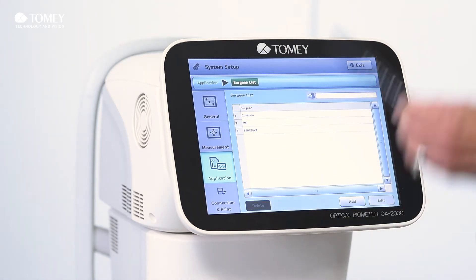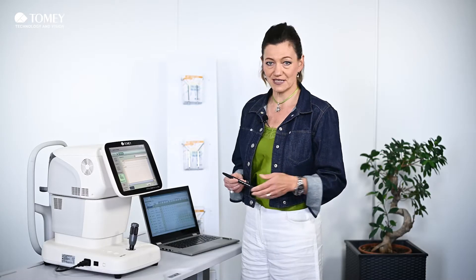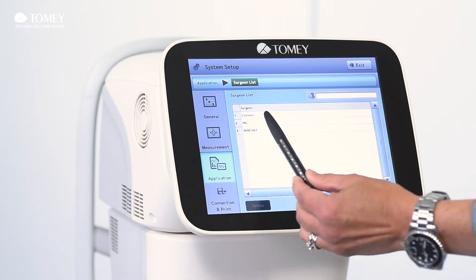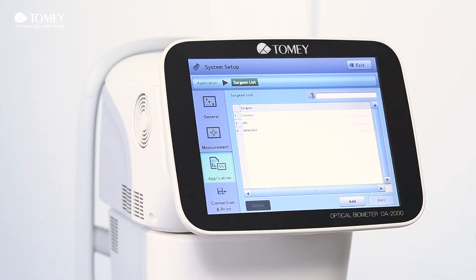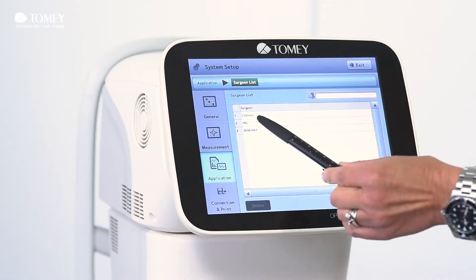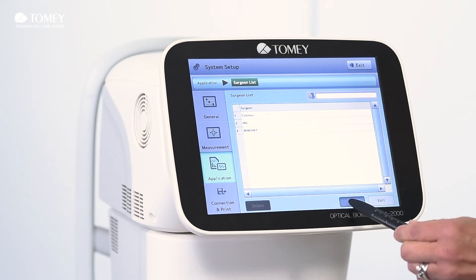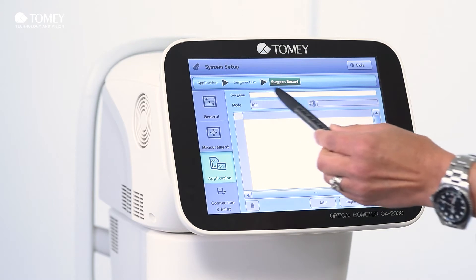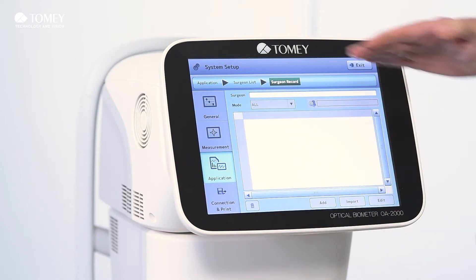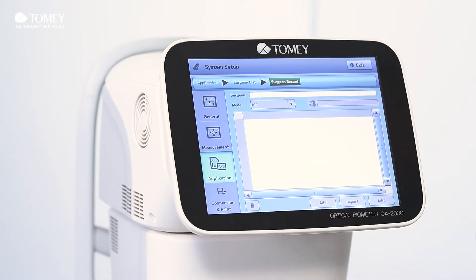Then you come to a surgeon list. The default setting is the name "common." Under the common name, you can of course store all the IOLs. If you are a private clinic, for example, there is no need to add extra surgeon names. But here you can add surgeon names just by simply clicking on the add button.